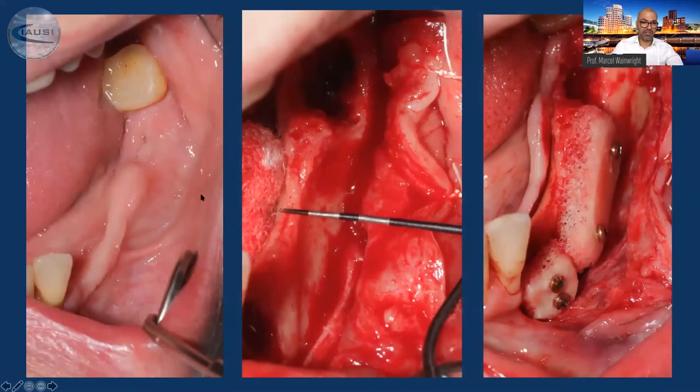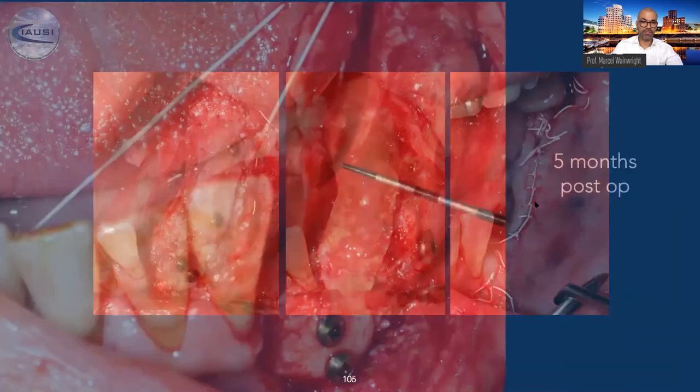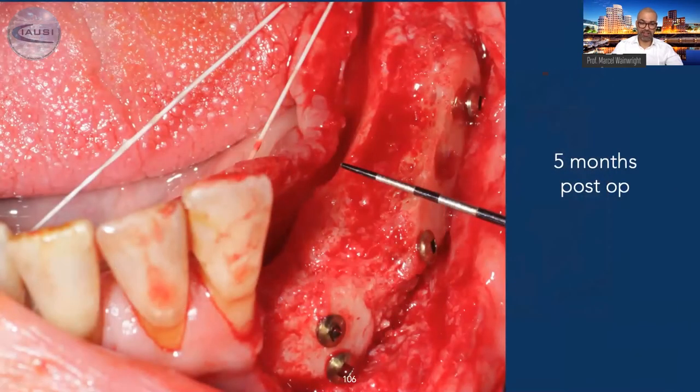Another case in the lower jaw — very compromised bone, big defect. Here, two bone blocks were directly screwed to the recipient site. We added some particulate material, placed a PRF membrane upon it, and achieved primary wound closure with a continuous mattress suture. Returning after five months, you see nice, vital bone, extraordinarily expanded in width. We take out the screws and place the implants.